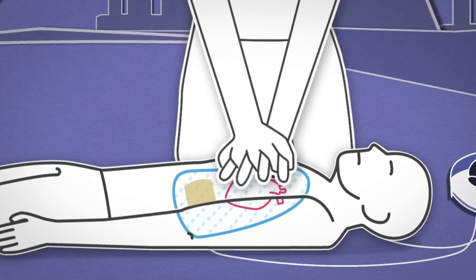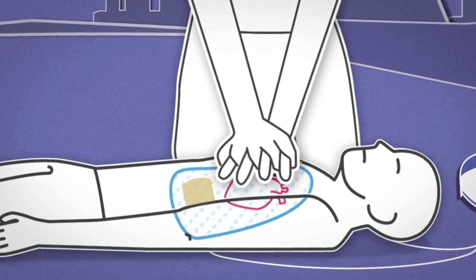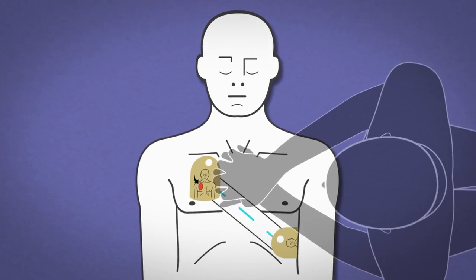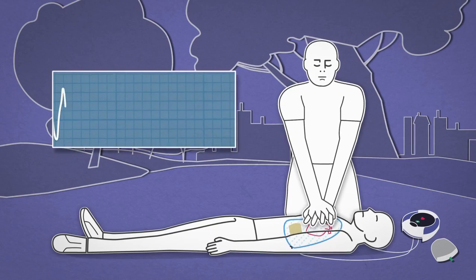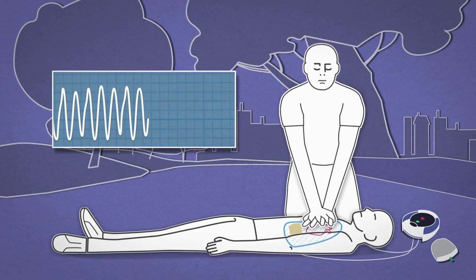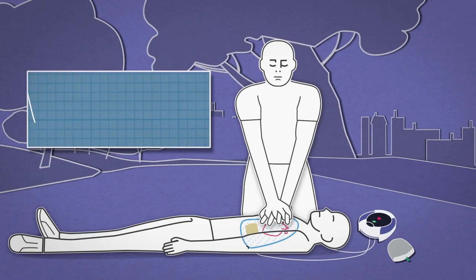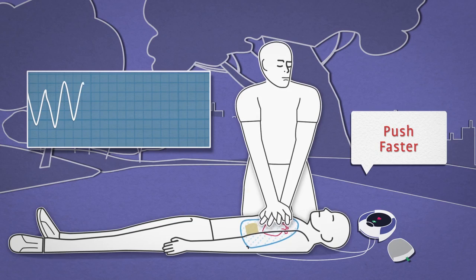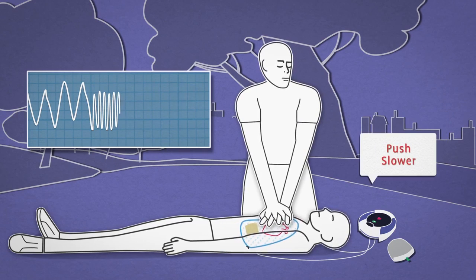When a patient collapses and a rescuer performs CPR, the compressions applied by the rescuer cause the patient's chest to change shape. CPR Rate Advisor captures this change in an ICG waveform, which it uses to count the number of compressions a rescuer administers. When the rescuer compresses the patient's chest, the rate is reflected on the ICG waveform. The greater the rate, the greater the number of deflections.